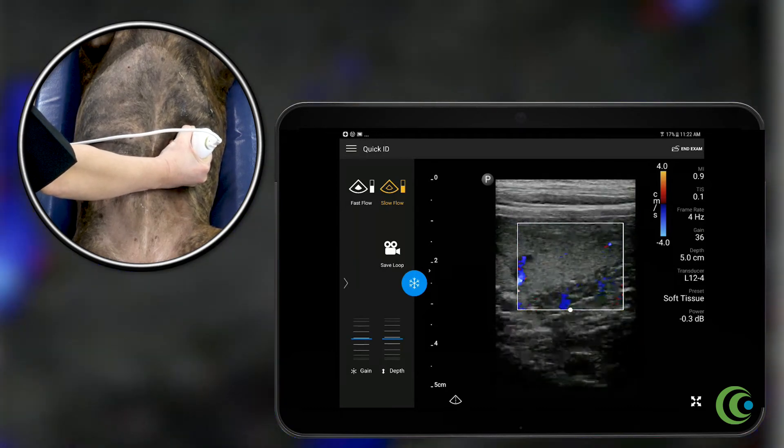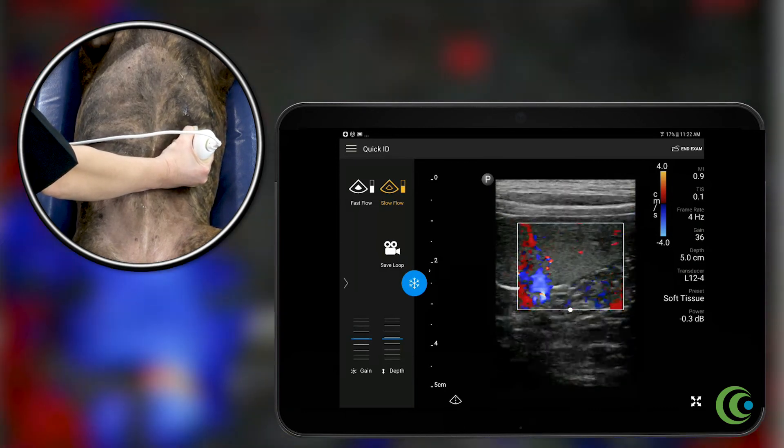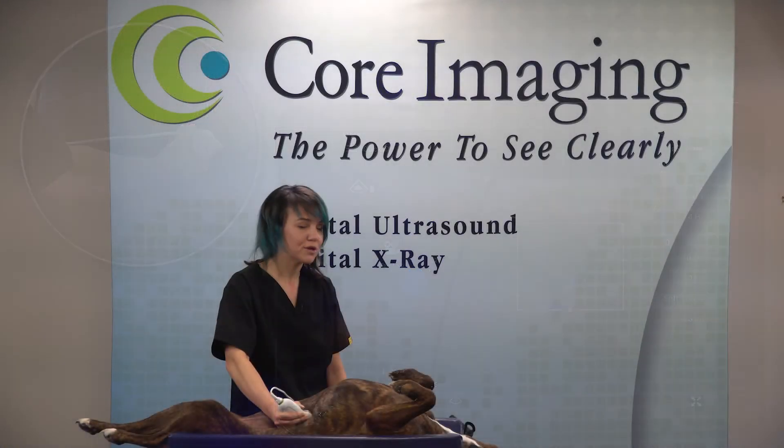Fan through the spleen, making sure you can see all the nice vessels. And that's how you use color Doppler on the spleen.